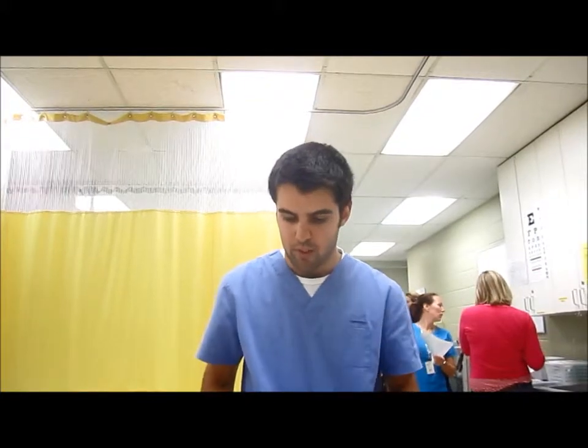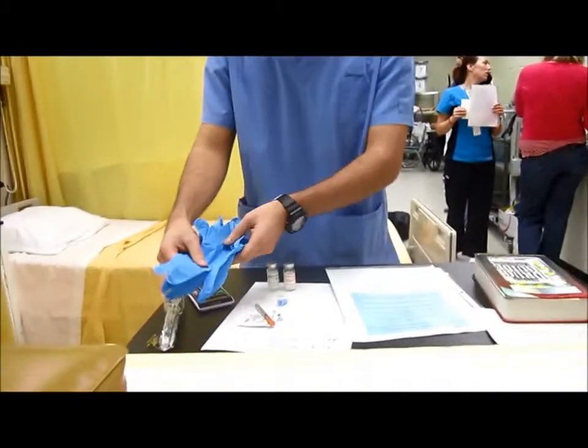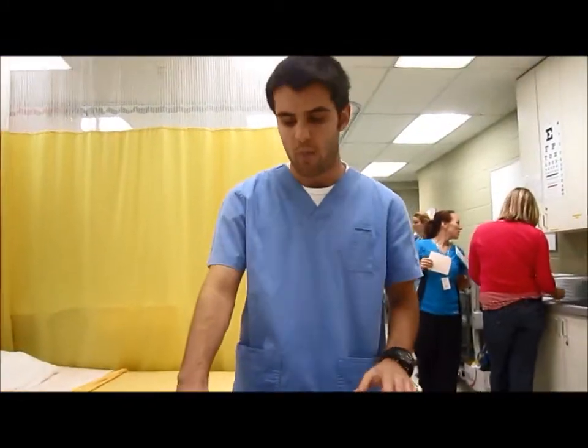Okay, so first I got all my supplies: insulin needle, alcohol swab, and gloves. Then I would go assess my client. So I would check her vital signs, any problems she may be having this morning. I'd obviously already checked her blood sugar and any contraindications this insulin might give her.